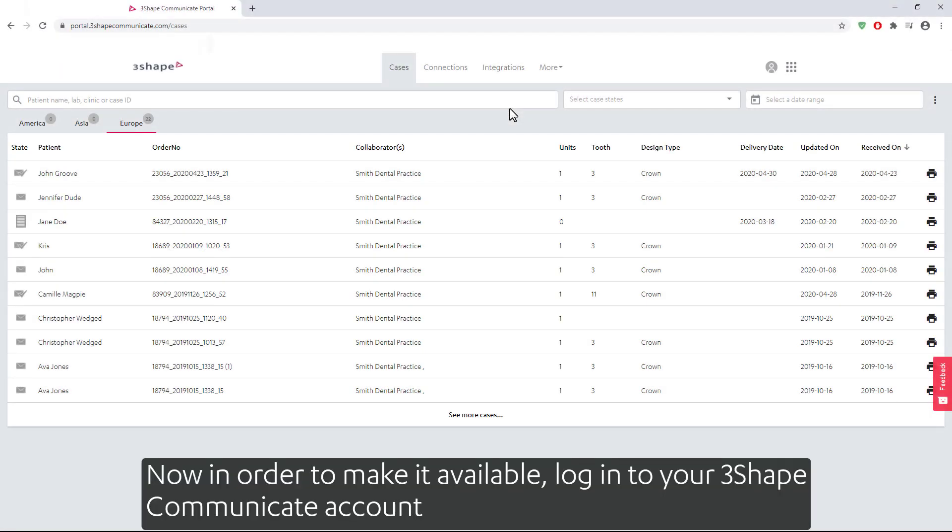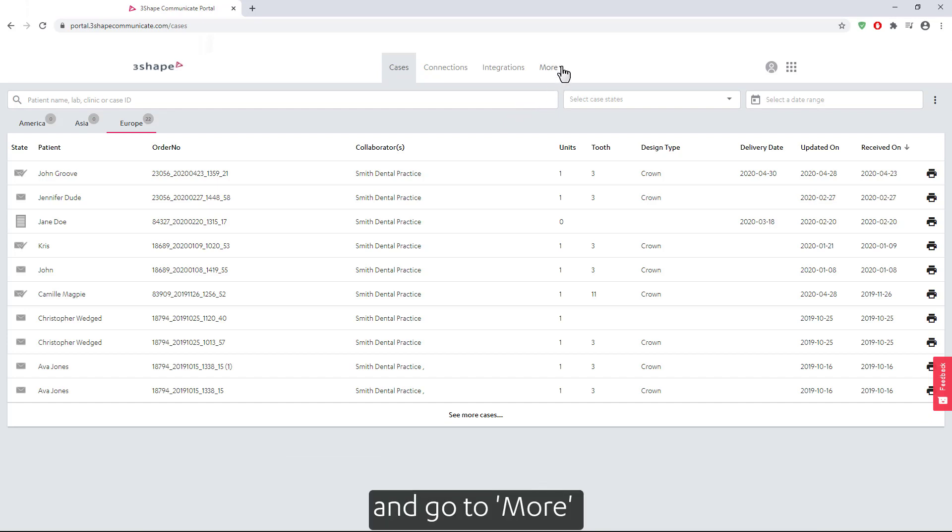Now, in order to make it available, log in to your 3Shape Communicate account and go to More and then DME.